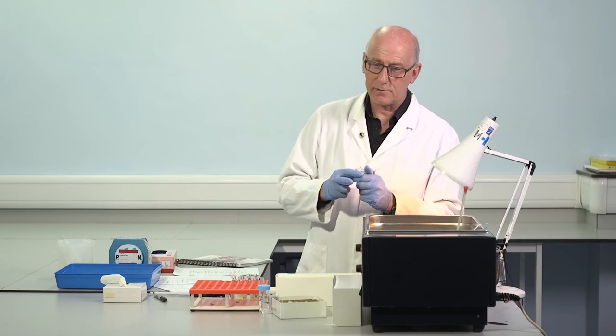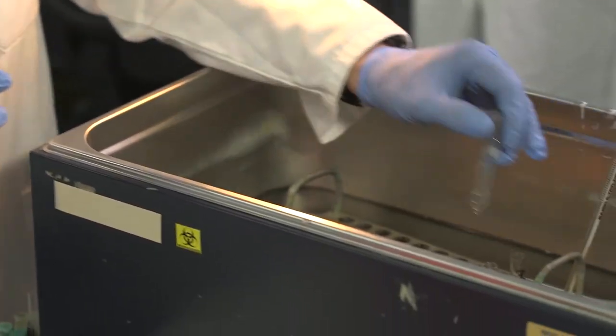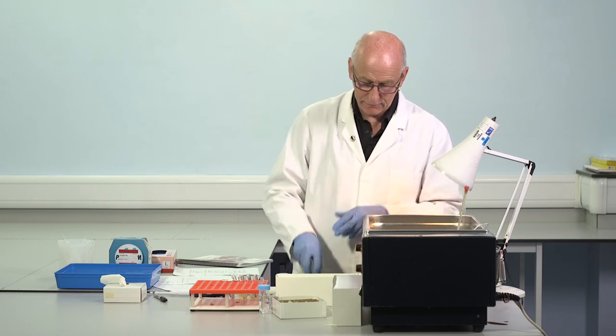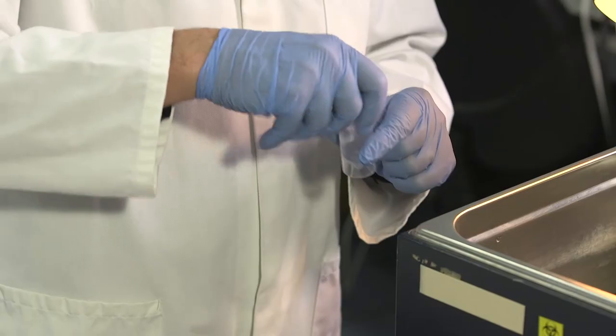This one actually contains a fluid phase activator, ellagic acid. So I'm going to replace this one that was warming up with the first one. Different APTT reagent. Make sure we've got enough. No, a little bit more calcium chloride.